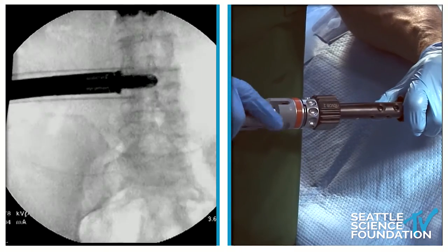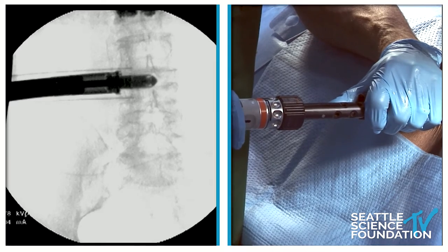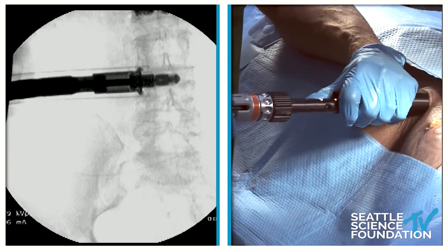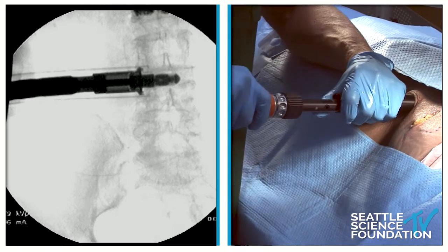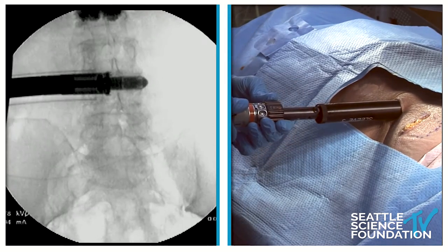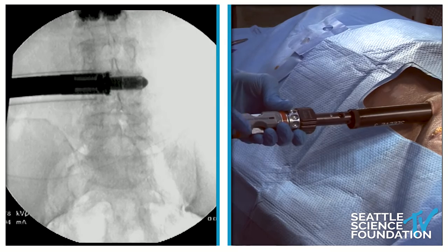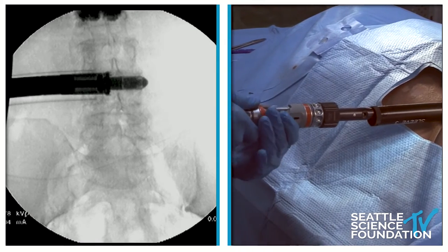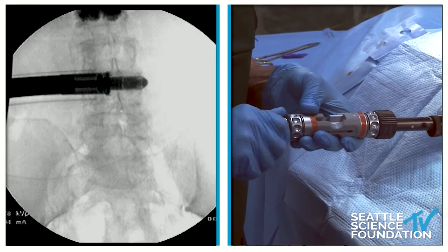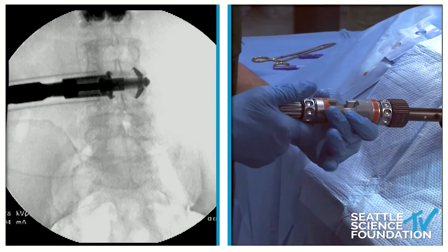Let's do an AP shot. We can see this going through. The fixed plate is the one you see with the teeth. The extension plate has wings — they're like a bird with its wings tucked in. We'll drive it all the way across. Then we're going to line up the laser lines — this has reference lines, it says wing reference right here. We're going to line this top to bottom because this is how the extension plate is going to open up. Going clockwise on the back knob — we can see this start to open up. We can see it open way up, and then I'm going to stop here.